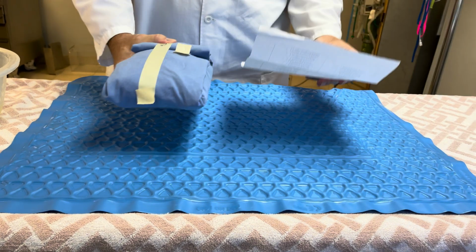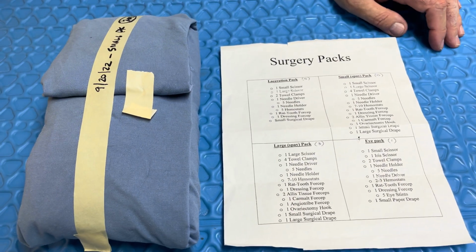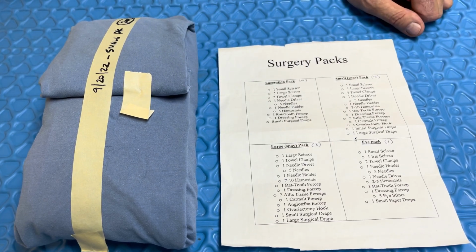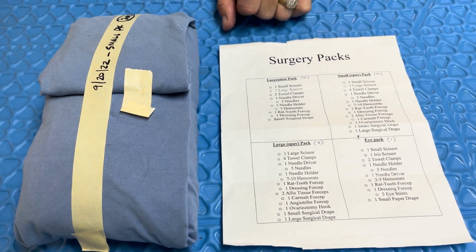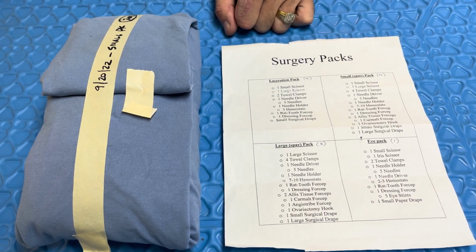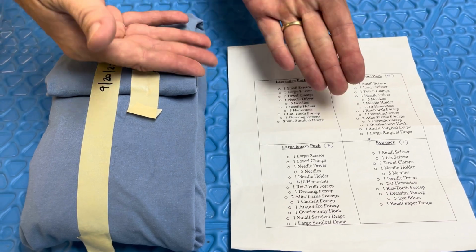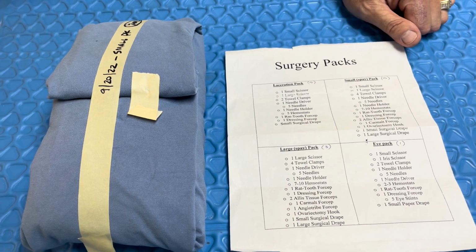So, that's it. There's the 4 kinds of packs, but we wrap them all the same way. They just have different numbers of hemostats in them, and Carmalts, and the laceration pack doesn't have a spay hook. Okay, if you don't have a spay hook, you're going to put it together on your finger and then lay it like you did with the spay hook. You can also put the bigger Carmalt through to serve as the spay hook piece.